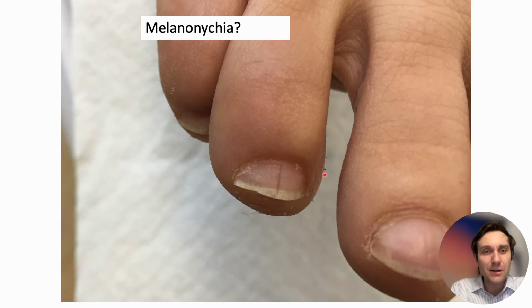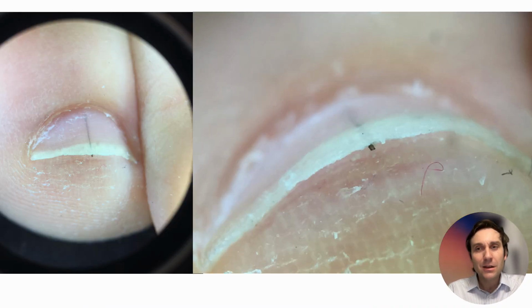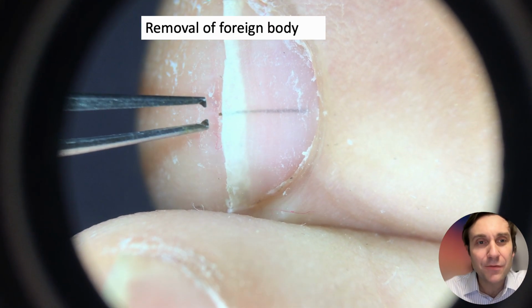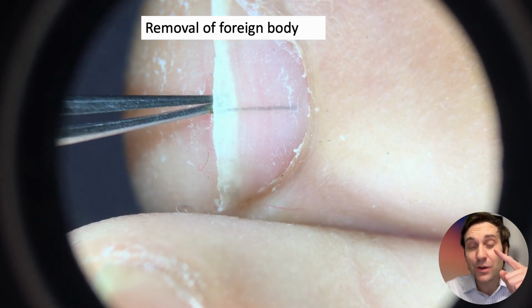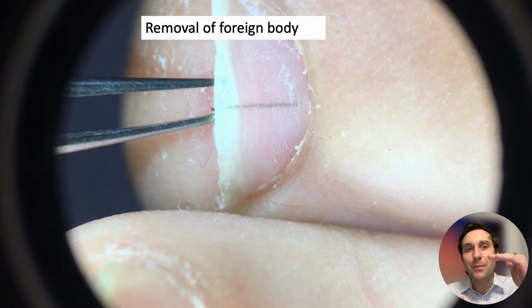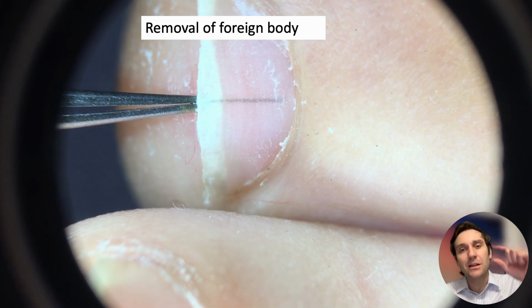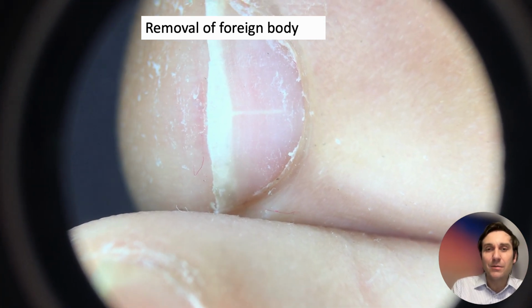Or what about this patient here? Is this melanonychia, right? Could be. Melanonychia, I will follow up the patient. Could be melanoma. But take a look with your dermoscopy. It doesn't look like melanonychia. It looks like something under the nail. And yes, dermoscopy can help you remove this foreign body. This is my forceps here. It's not easy to understand the three-dimensional field when you're using the dermoscope. So this is a special adapter for suture. Look at that, foreign body removed.